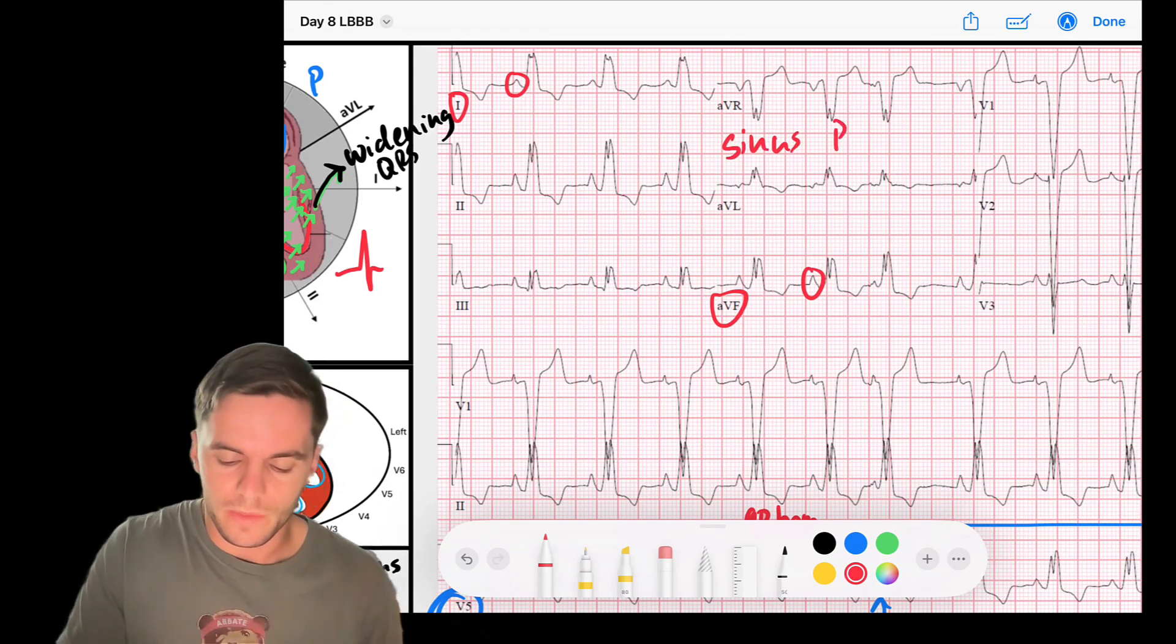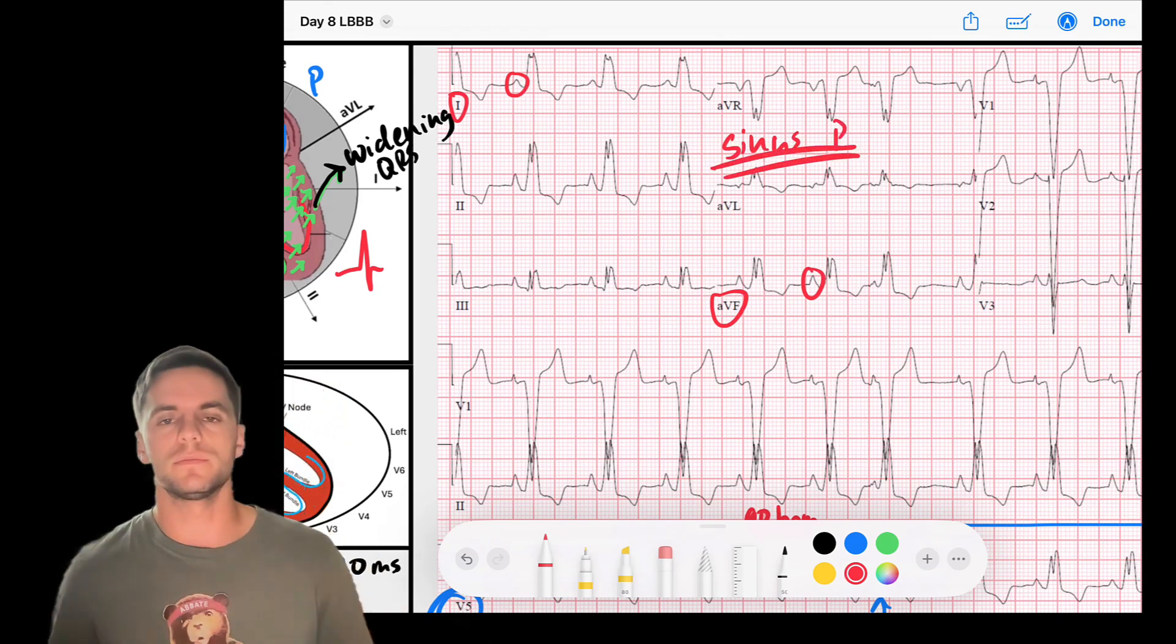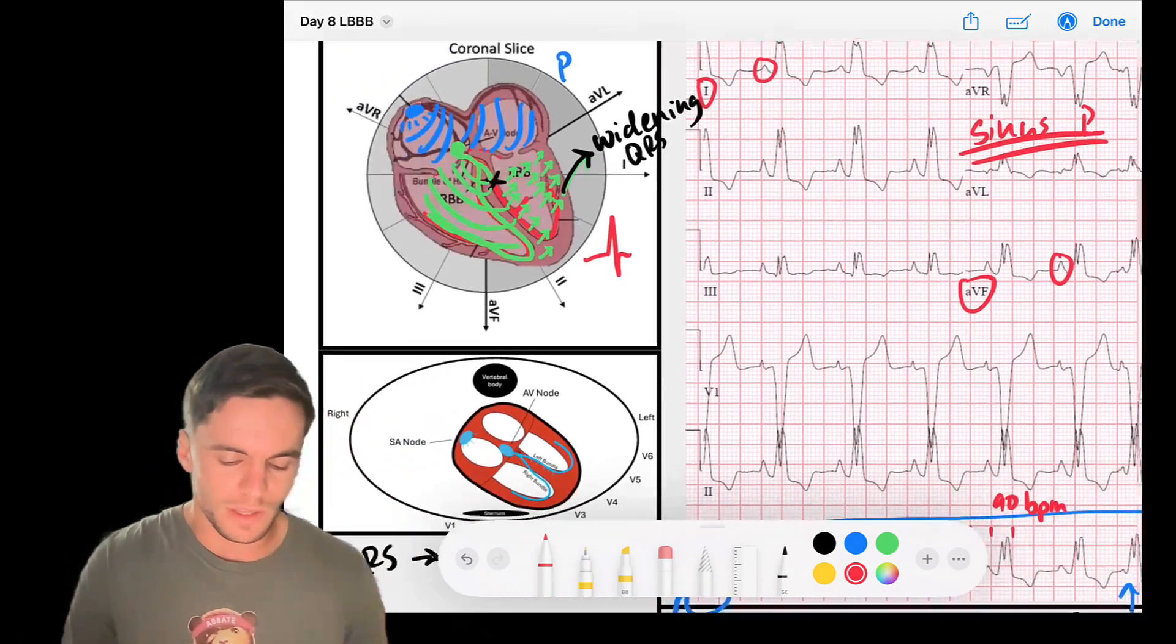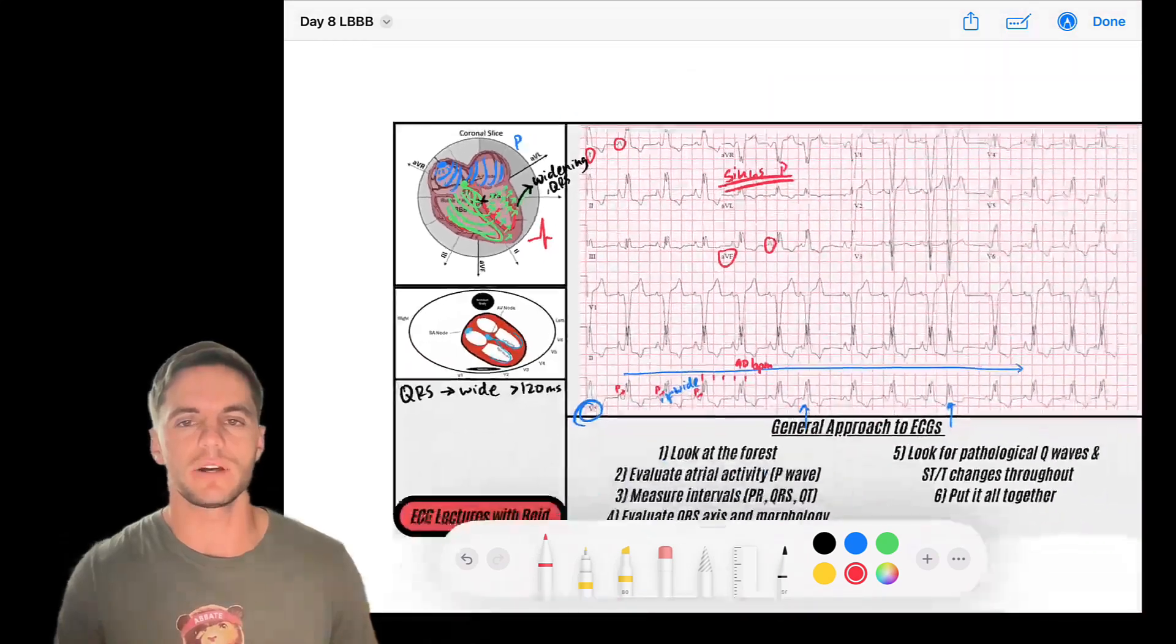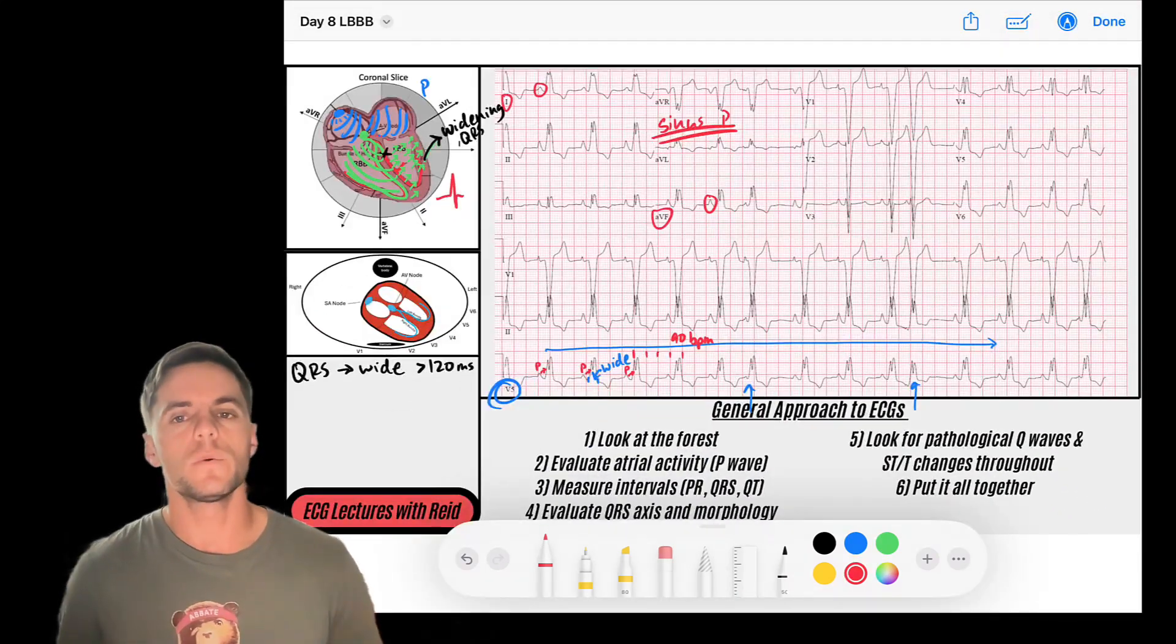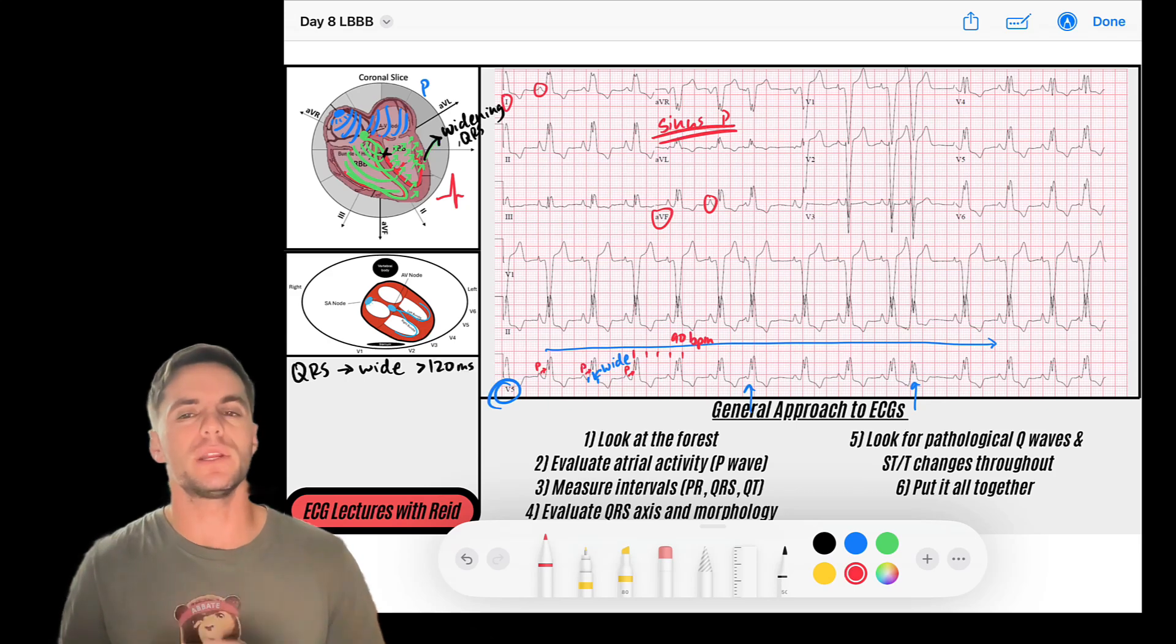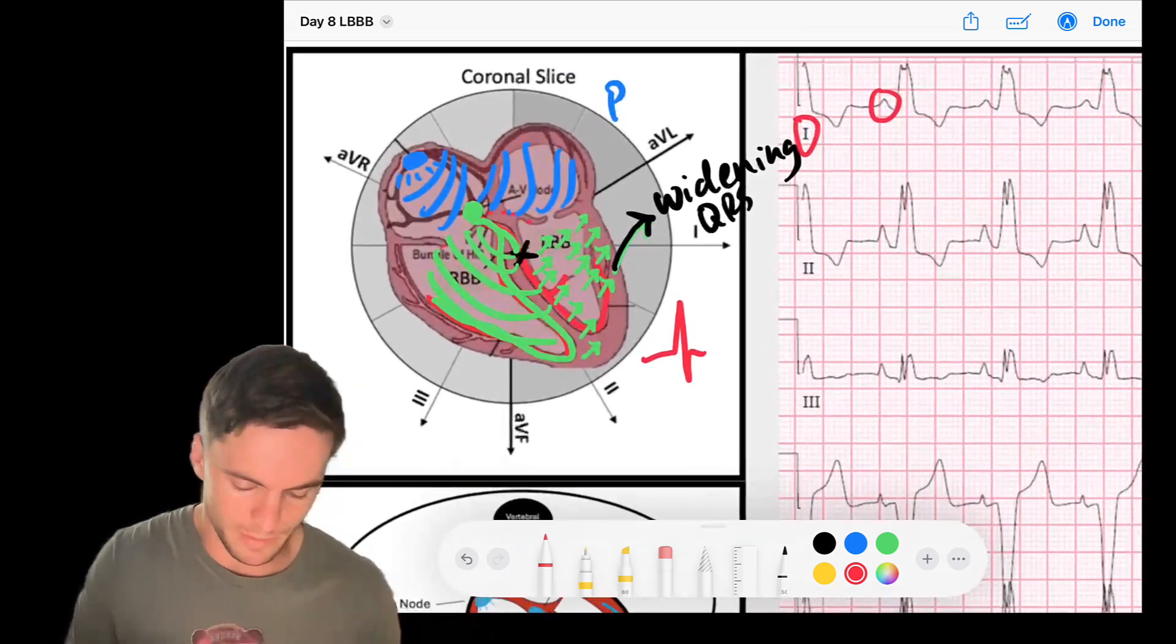So remember, we have a sinus rhythm now with normal AV conduction, but it's conducting to a wide complex QRS. So that makes me think that maybe there's a bundle branch block like we talked about. So we know that you can have a right or a left bundle branch block. So now it's our job to determine is the wide complex QRS fitting a morphology that we should expect to see, morphologic changes that we should expect to see in a bundle branch block pattern.